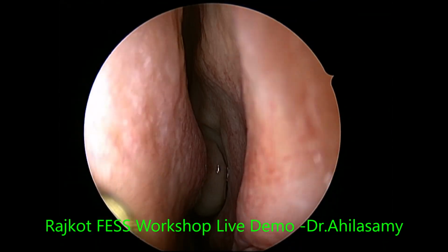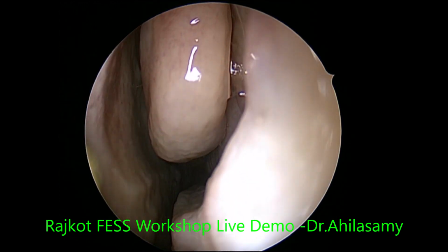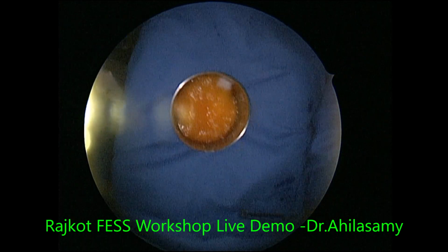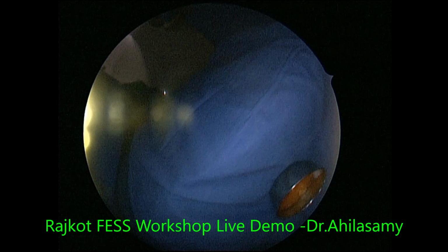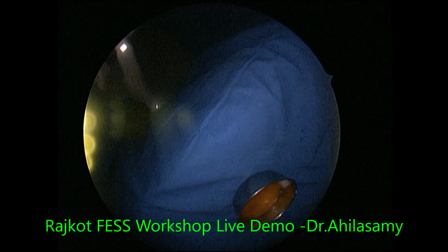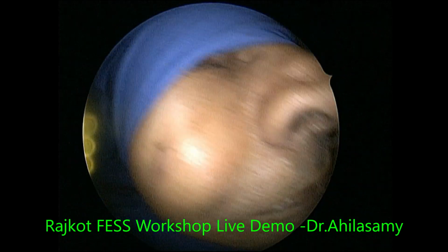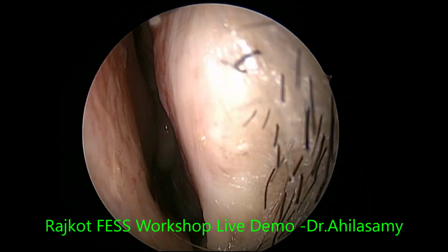So after infiltration, I am packing the area with the 4% lignocaine with adrenaline pack. The video will be a little lengthier because the Savlon and the setup, all these small things, are not cut and removed, edited.